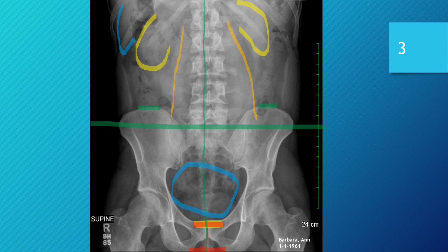So the contrast is not terrible. We are able to make some differentiations for soft tissue structures, but I feel like maybe this image was adjusted a bit after it was taken. But overall, it looks like the technique was pretty good. The difference between our bony structures and soft tissue is very evident. And in general appearance, it's a very clean image. Very, very good technique for a belly. Like I said, I think it was just adjusted some post-processing.